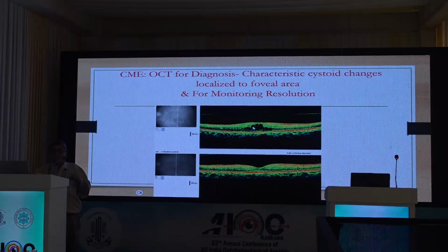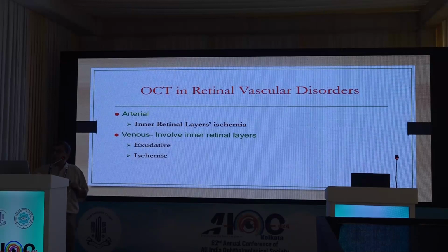You do a cataract surgery. Patient not improving. Just do an OCT. You see there's CME. Treat this patient with NSAIDs and low topical steroids. This is what you'll get. Normal. So, for you to ensure good prognosis for your patient, good outcomes, this is an important thing.